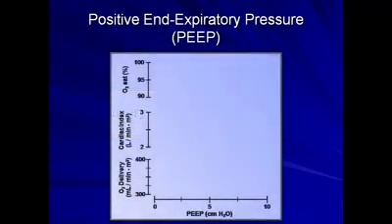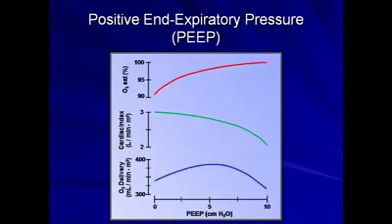This chart demonstrates why this might be important for patients receiving PEEP. In nearly all patients, increased PEEP leads to increased oxygen saturation, while in patients who are either euvolemic or hypovolemic, increased PEEP can lead to decreased cardiac output as a consequence of impaired venous return. Thus, there is a sweet spot where an optimal PEEP provides a trade-off between O2 saturation and cardiac output in which peripheral oxygen delivery is maximized.